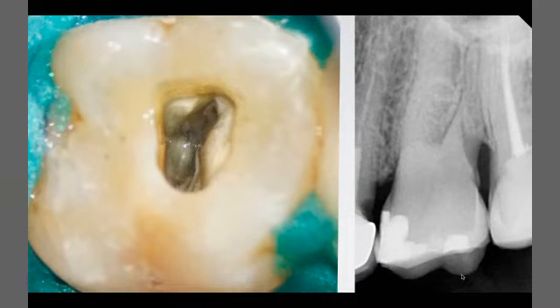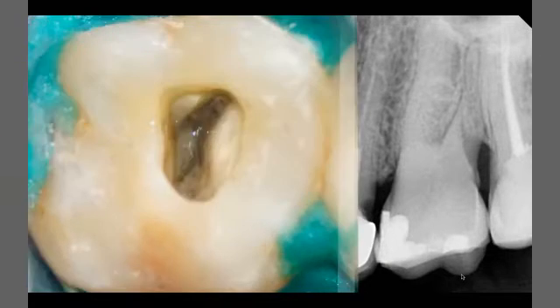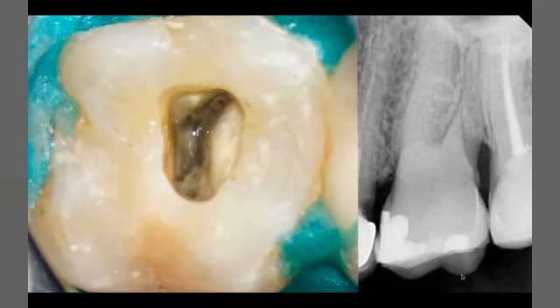So I have to remove the calcification again on the distobuccal and palatal, and then everything will be okay, because the root canals are not calcified. The only calcified part of this tooth is the pulp chamber. So when we remove all the obstacles in the pulp chamber, we can proceed to the apex with the manual files 6, 8, 10, and then enlarge the glide path, and complete our root canal treatment.